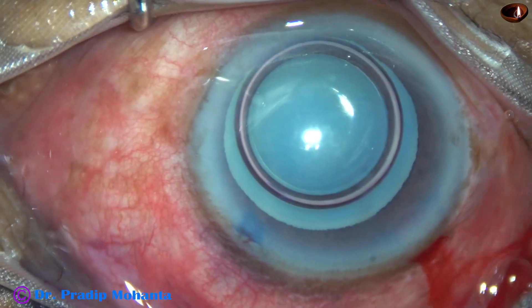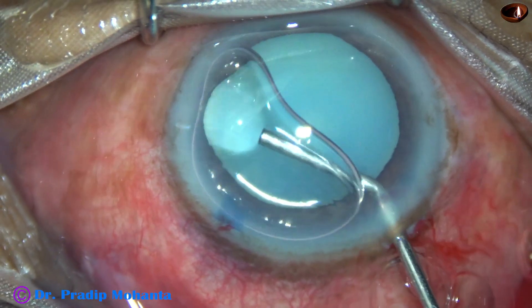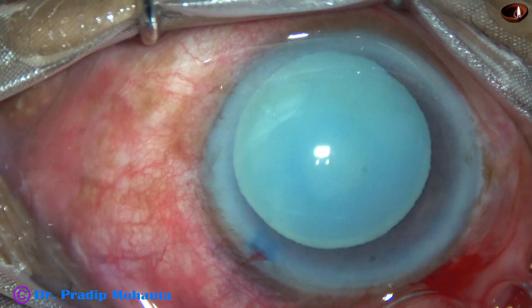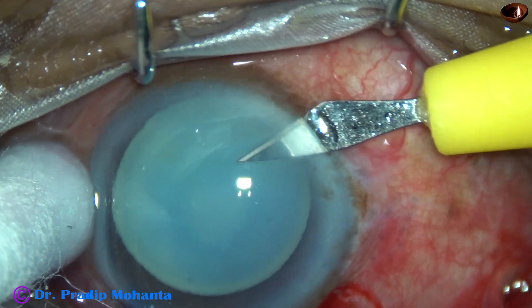And now the anterior chamber is filled up with 2% hydroxypropyl methyl cellulose. And now a side port is made on the right side of the main incision, about 3 clock hours away.